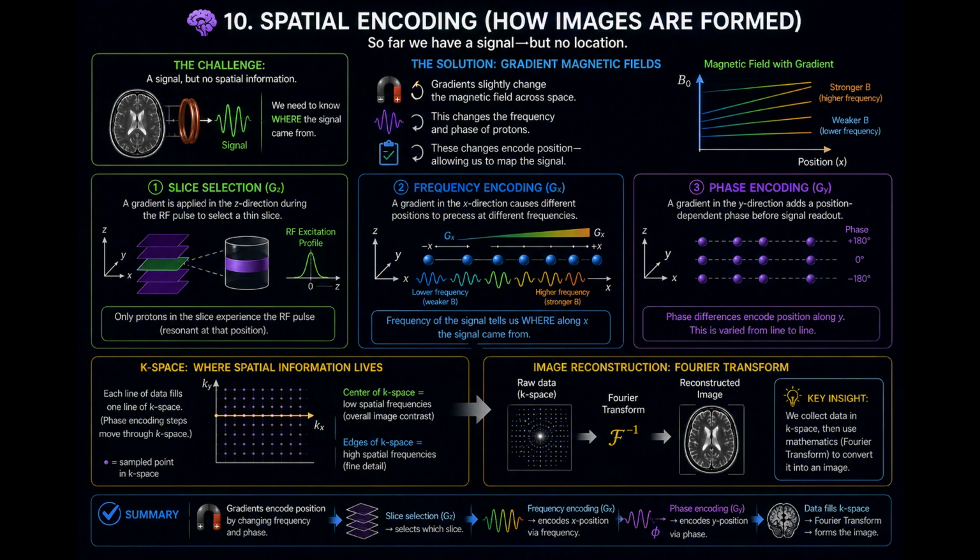Stick with me now. So if you want to get a cross-section image or an axial, you would use the head-to-toe gradient for slice selection because we want to make each slice location unique. Gradients slightly change the magnetic field. Now think about playing the game Battleship. To win, you have to guess the coordinates of the ship. B12. The other two gradients not being used for slice selection are used for frequency and phase encoding.